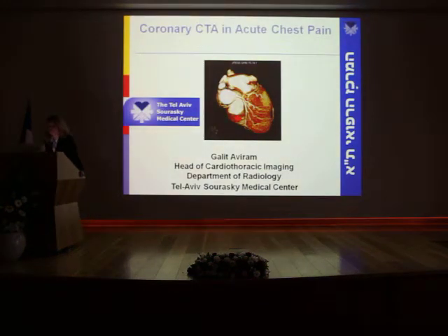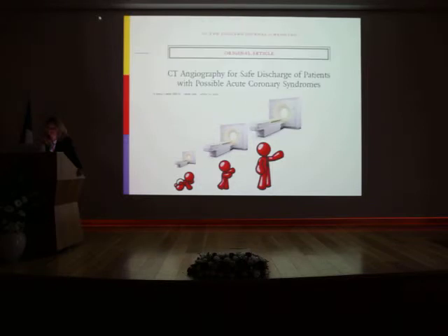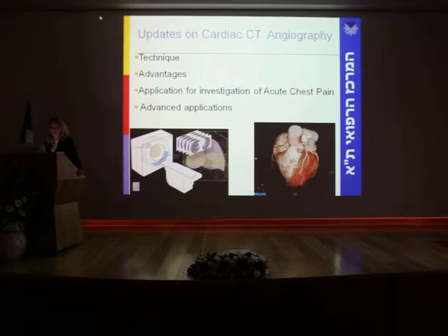Good morning. We're going to a different area. The technology of cardiac CT is actually very, very young. It was born in the beginning of this millennium, and it has made such tremendous progress that this year, 2012, the New England Journal of Medicine published an article stating that CT angiography is safe for discharging patients with possible acute coronary syndrome. So this morning I'm going to briefly review the technique, the advantages of this technology, application for investigation of acute chest pain, and I'll touch shortly on advanced applications.